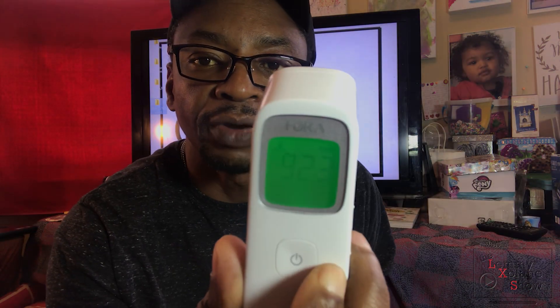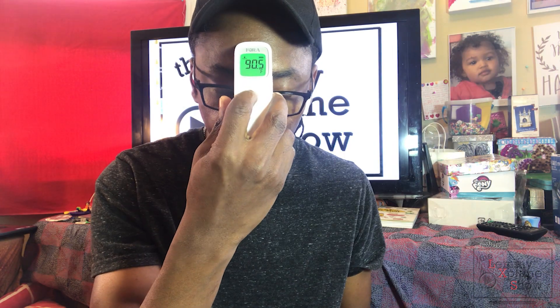Let's go ahead and try it — 92.5, that was a quick reading, under two seconds. Let's do it again: 92.3. One more test on the forehead: 92.7... 93.4. Very easy to use, very straightforward.